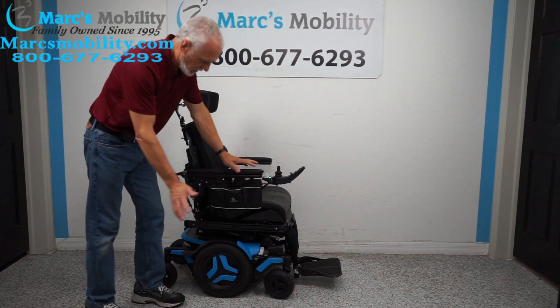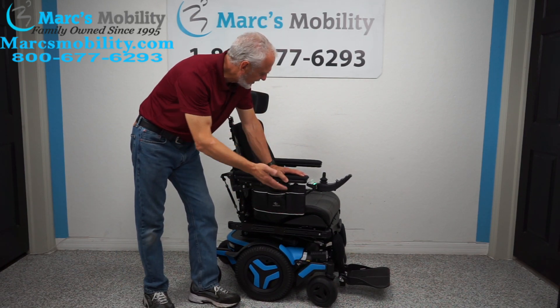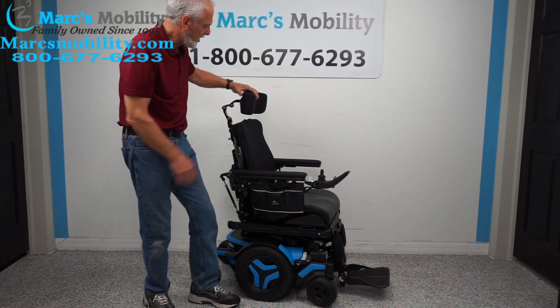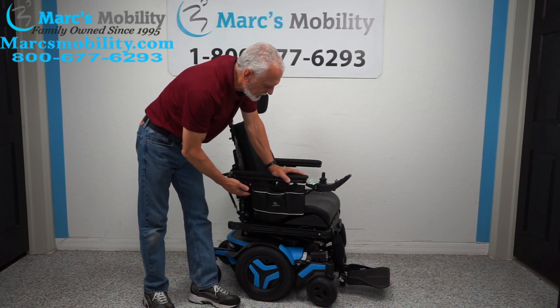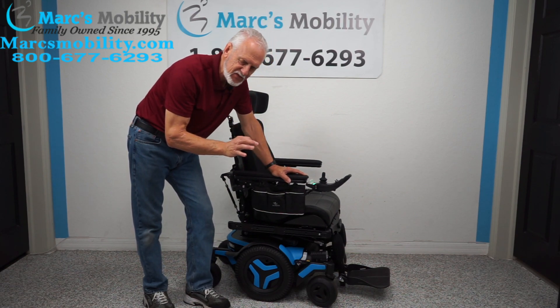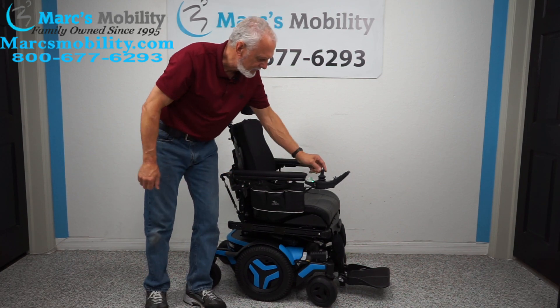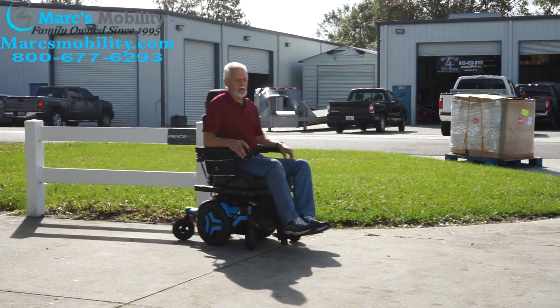Let's recap: we have a Permobil M3 power chair in blue, practically brand new with 41 miles. It has the 12-inch seat lift, electric tilt, electric recline, and electric feet. It includes gel arms, a swing-away joystick, an adjustable custom headrest, factory headlights, incredible suspension, and solid tires all around. Maximum user weight is 300 pounds, and top battery range is up to 15 miles — though mileage varies based on speed and terrain.